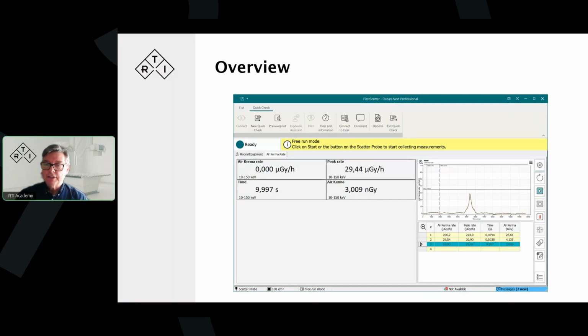What is the ideal selection mode for area survey tests and tube leakage, 10 or 100? Well, for tube leakage, it is 100 square centimeters. That is the standard, what it says. And then, of course, you need to decide, do you want to follow the standard and be compliant, or do you want to do something else? That's up to you to decide. But the global standards call for 100 square centimeters. So you need to decide.